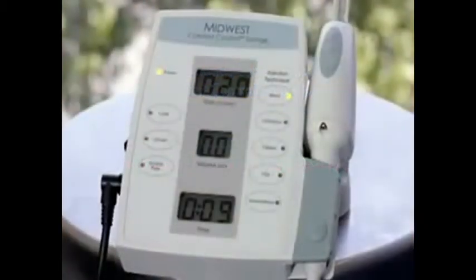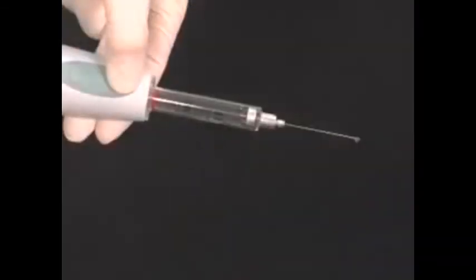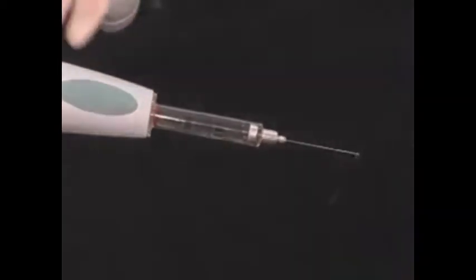The comfort-controlled syringe system has specific pre-programmed injection rates for 5 specific techniques. Both the Compudent wand and the comfort-controlled syringe system have the ability to aspirate via simple controls.